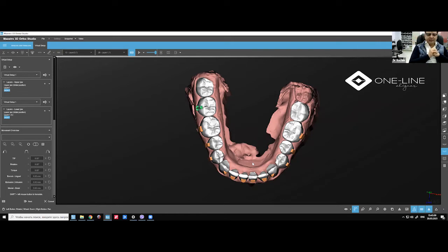For my lab, it's not really convenient to have so many different sheets for all kinds of movements. What I've seen in my lab, if I use a 3-layer, which is the CA Pro Plus from Scheu Dental, it is effective for almost all kinds of movement, for expansion, for intrusion, and then I don't need to change the thickness of the sheet every time, because I have to write down everything on my sheet.